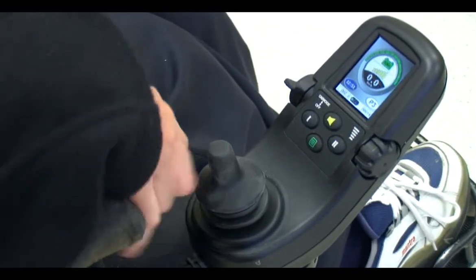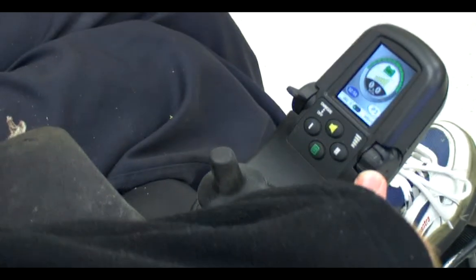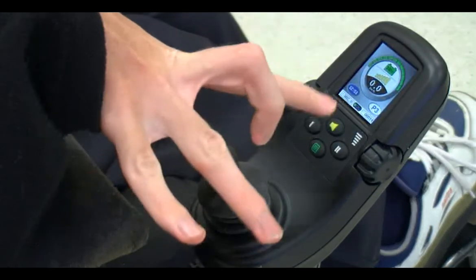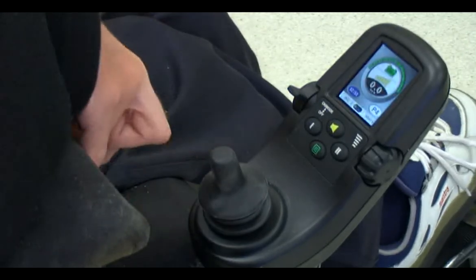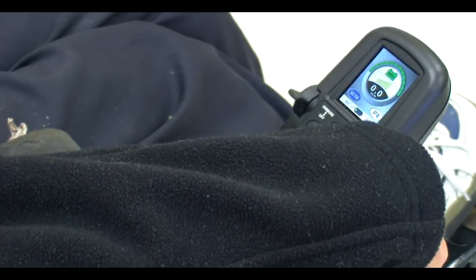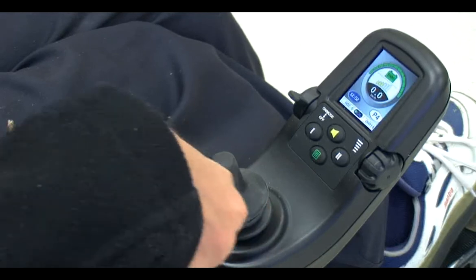To adjust the speed, you can either move this knob on the side, or you can change the program. Right now I'm in program 3. You can put it into program 4, and then you're on fast speed. But if you want to go slow, you can turn that down.